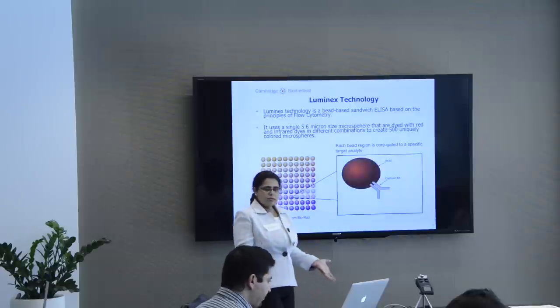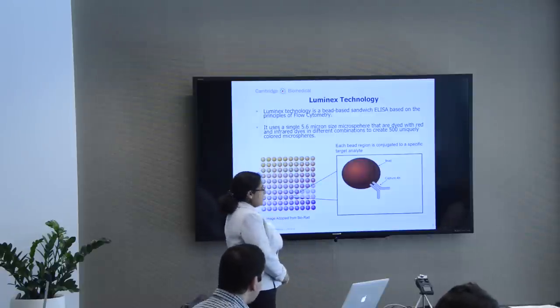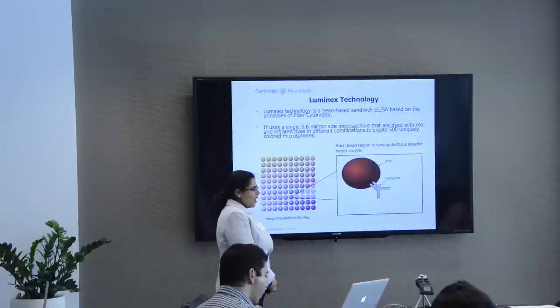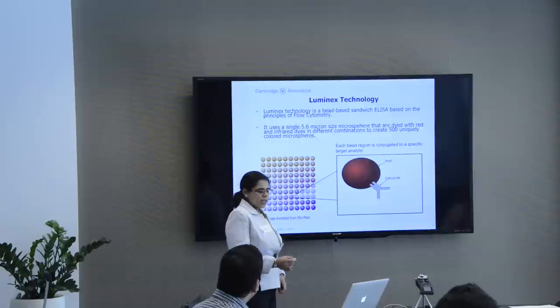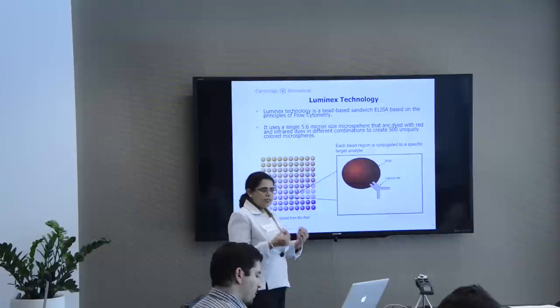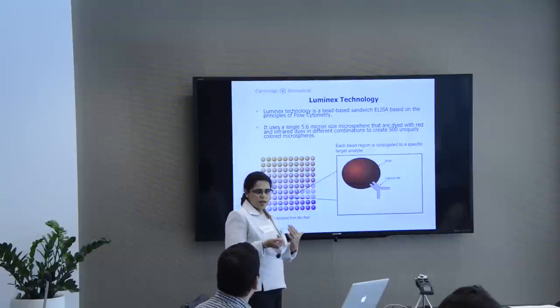Just as a background, I know everybody knows about Luminex, but to start, Luminex is a bead-based sandwich ELISA, and it is based on the principles of flow cytometry. The difference Luminex has from flow cytometry is that it uses a single 5.6 micron size microsphere, or bead. These beads are dyed with red and infrared dyes in different combinations, and it's that different combination of dyes that lets you create approximately 500 unique beads. Each bead is conjugated to a specific target, or your capture antibody.